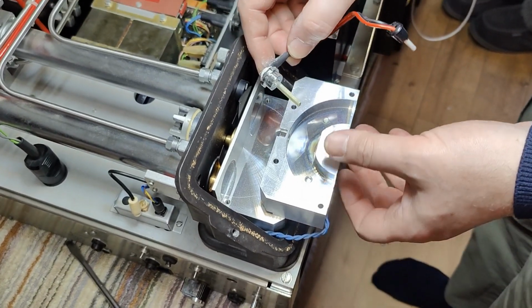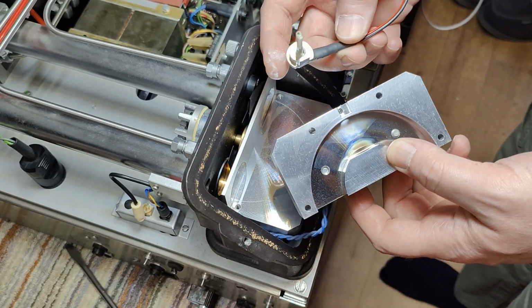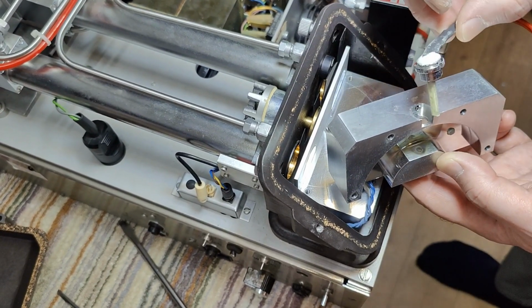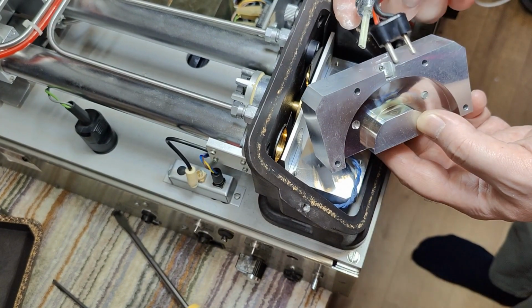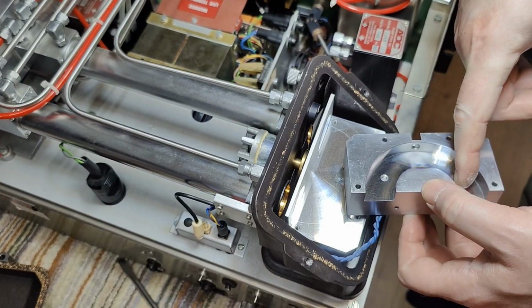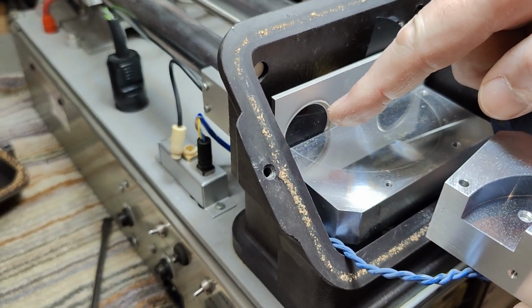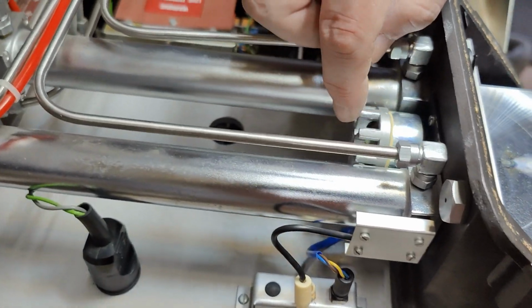So in here, that one, I thought it was a sensor, but I think this one is the emitter. This is probably infrared, because you can see the burning mark down here. So this one was probably mounted like that, right? And so this one goes red glowing hot, and so it emits infrared to each of the two sensors here. See, that's a glass, so it's not the heat, but it's the infrared rays that go through here, and then they are opened and closed in the two different ways.